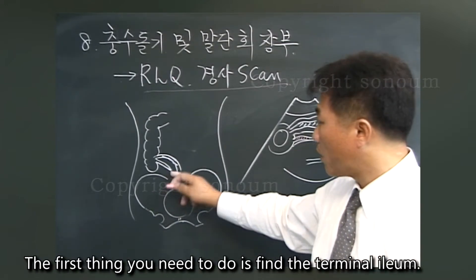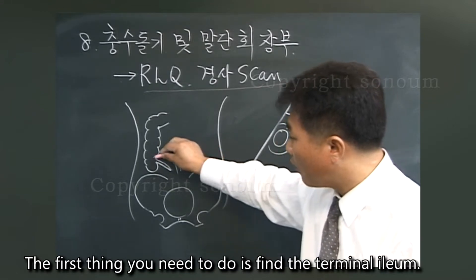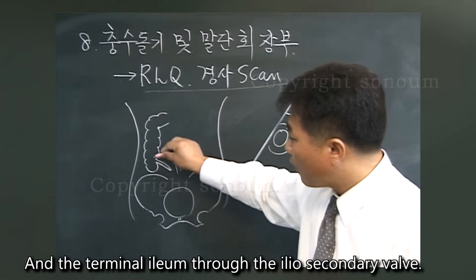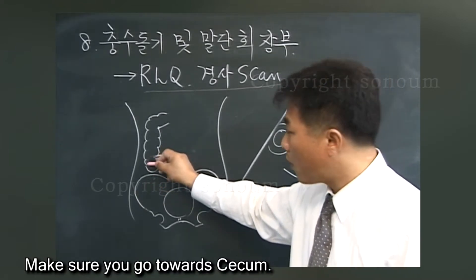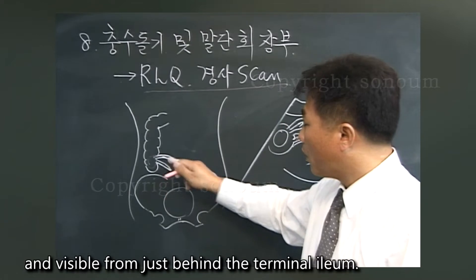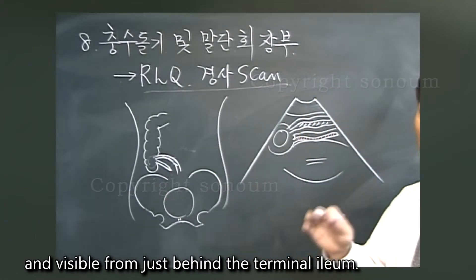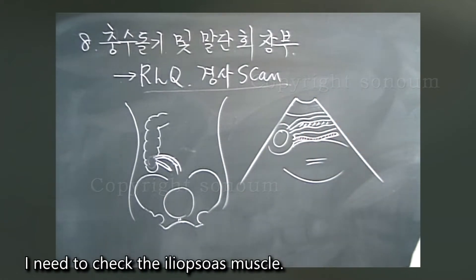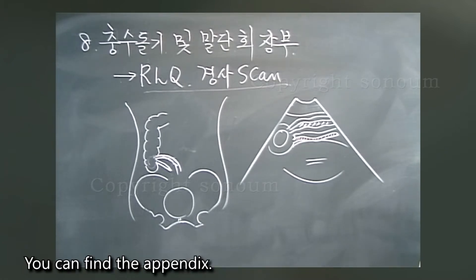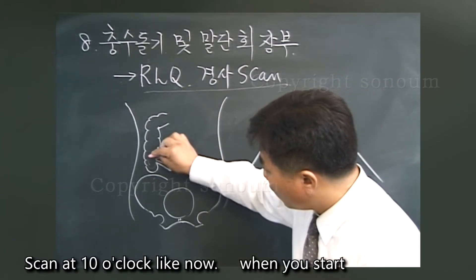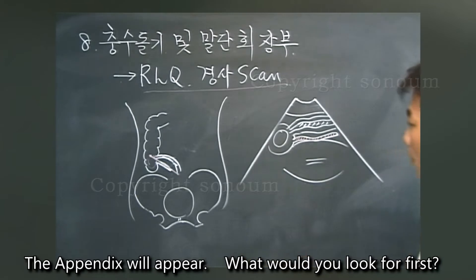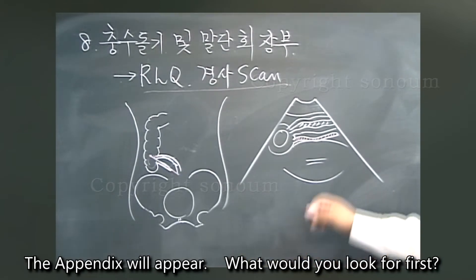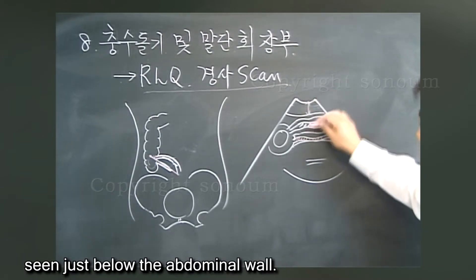The first thing you need to do is find the terminal ileum, through the ileocecal valve. Make sure you identify the cecum, visible from just behind the terminal ileum, then check the iliopsoas muscle to find the appendix. Scanning at 10 o'clock, the appendix will appear just below the abdominal wall.